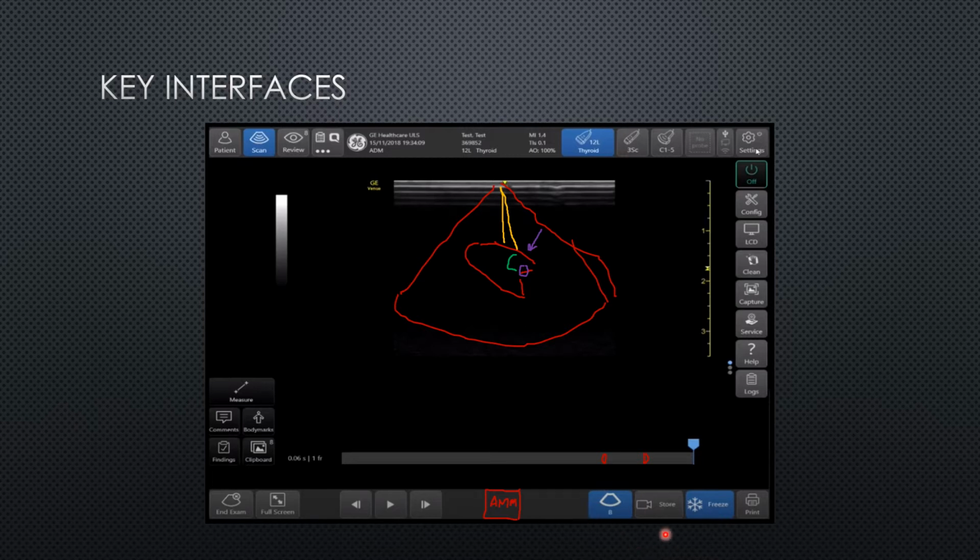And then maybe you were changing your settings, or you moved the probe at the beginning of the clip, and you're like, oh, this is kind of seizure inducing, right? Or this is going to look like an oopsie clip because half of it's worthless. I have about half a second of whatever I'm trying to image, and then 3.5 seconds of essentially garbage, right? So this way you can cut it down to just have what you want, which really improves the quality of your image when you don't have a bunch of time of you just searching to find the structure, and afterwards I'm looking and going, what are they trying to show me here? So it makes it a lot easier to send much nicer pictures across.